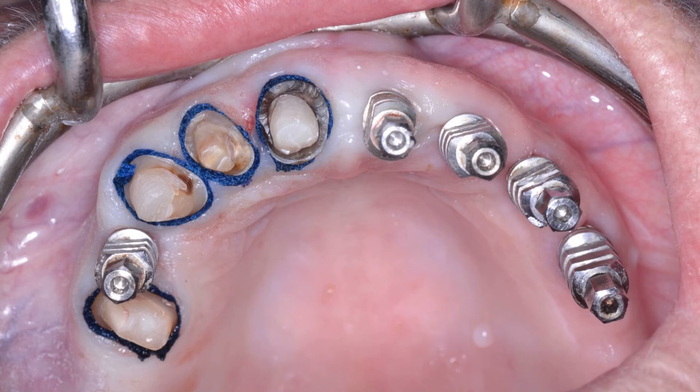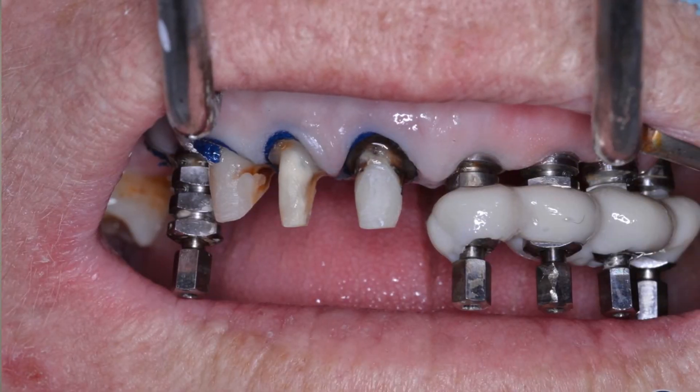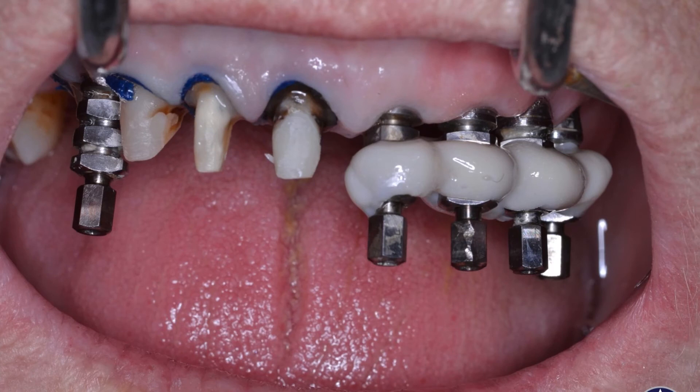Looking at the shot with crown preps and retraction cords in place, one can see the nice tissue — this patient had excellent oral hygiene around the implants and the tissues are nicely retracted. For any multi-unit case, you need to lock your impression copings together using a material with slow set to minimize polymerization shrinkage. The literature recommends GC pattern resin, Duralay, or inlay pattern resin as the best options; composite resin as second best; and triad or light-cured polymethyl methacrylate as the least preferred.